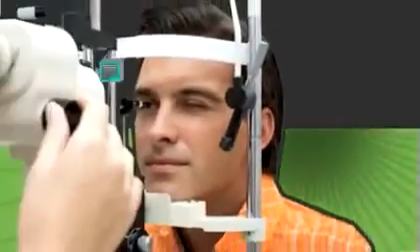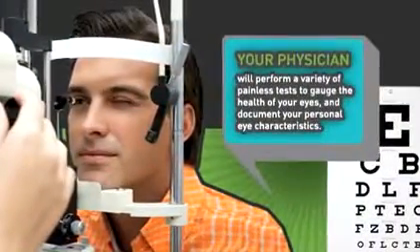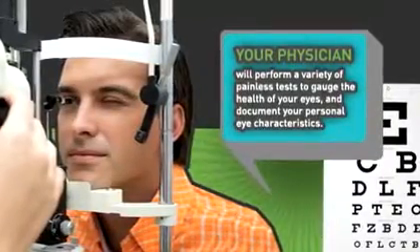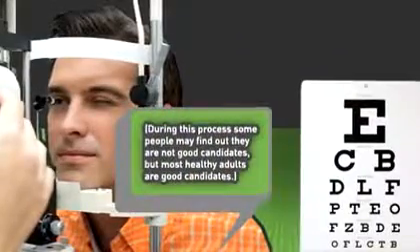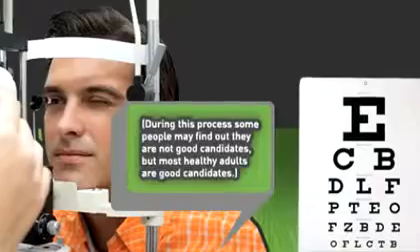Before having the iLASIK procedure, there's a critical evaluation step. Your physician will perform a variety of painless tests to gauge the health of your eyes and document your personal eye characteristics. During this process, some people may find out they are not good candidates, but most healthy adults are good candidates.